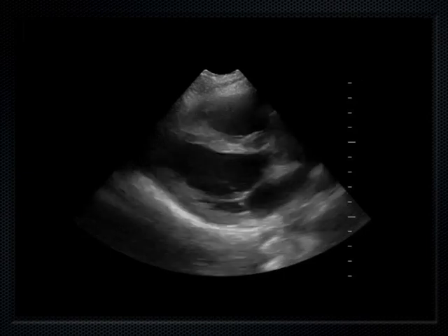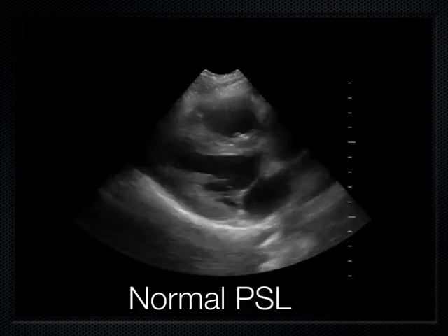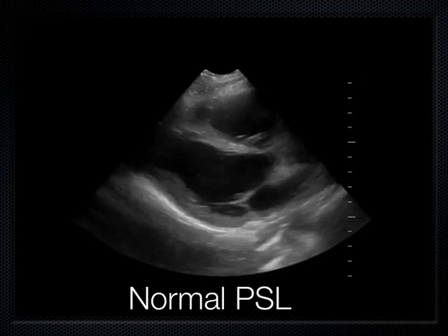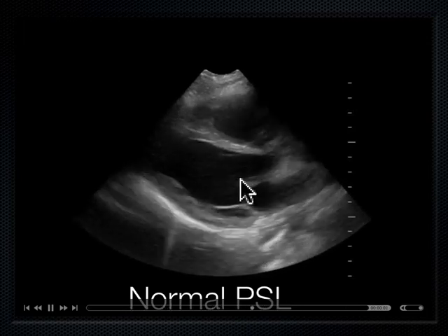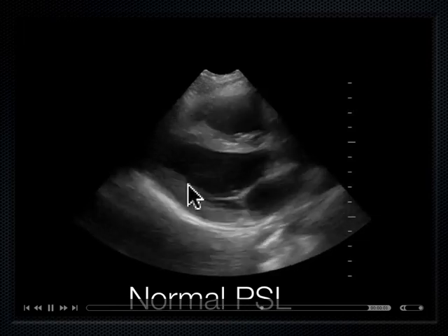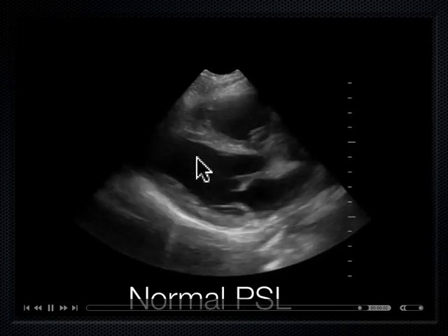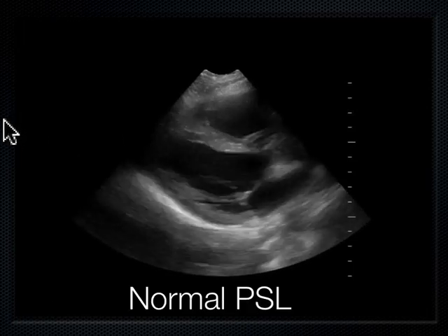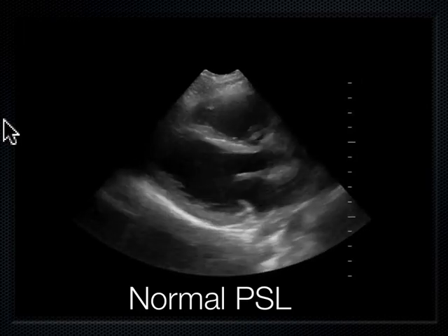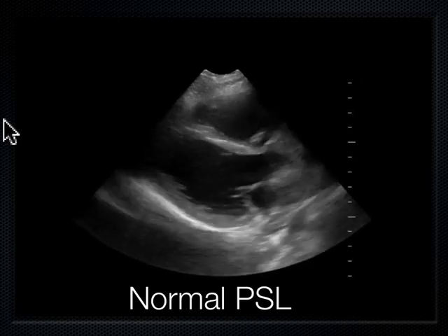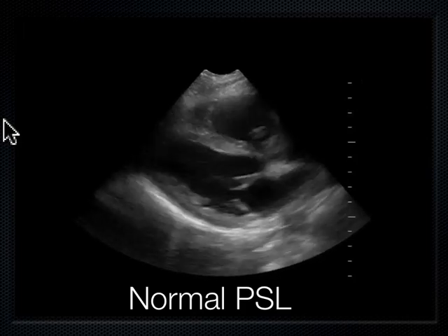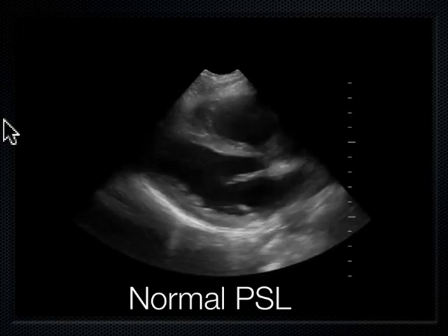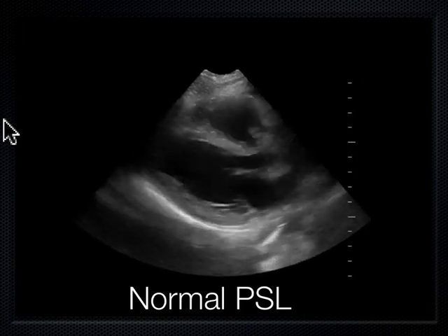This is what a nice normal parasternal long axis looks like. I'm looking for two main things: that the mitral valve comes up and smacks that septum, and that the posterior wall and interventricular septum make their way towards each other — and indeed they are doing that in this view. Clinically, if I have a hypotensive patient with a blood pressure of 70 over 40, if I saw a normal functioning left ventricle like this, I could safely give this person fluids — that would probably fix their hypotension.